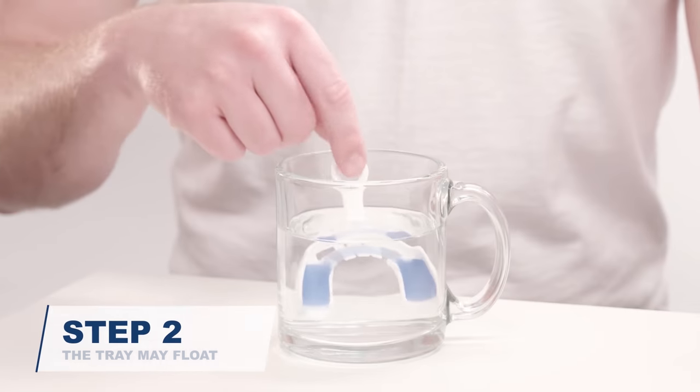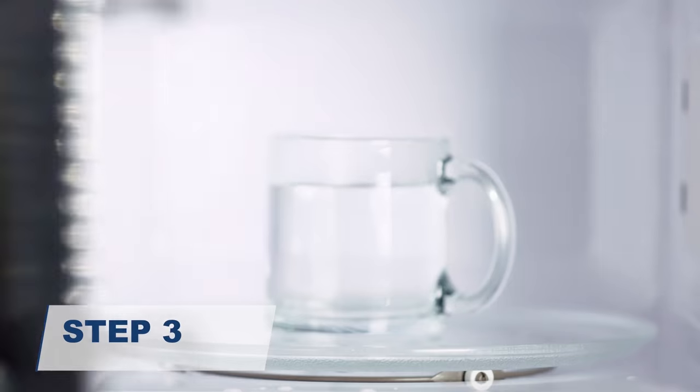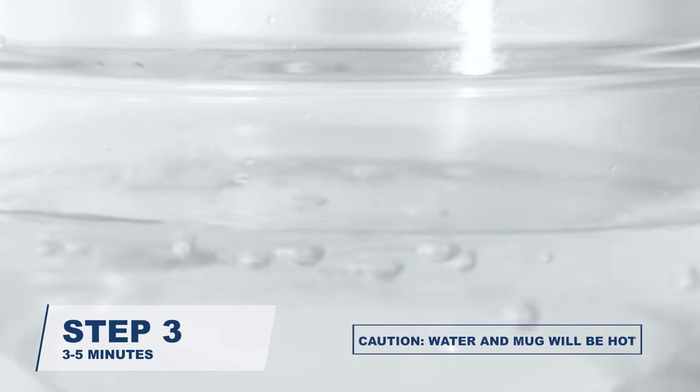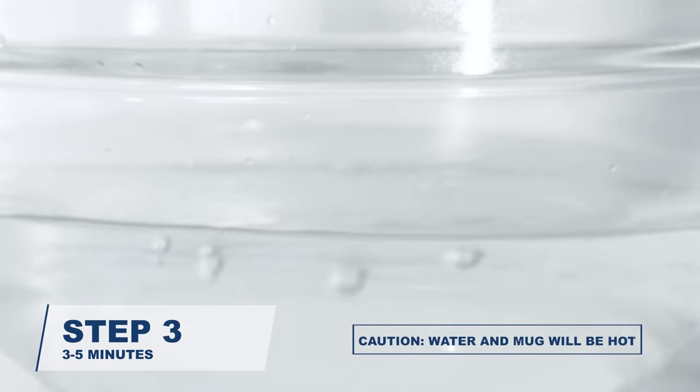Remove the forming tray from the cup. Place the cup inside the microwave and bring the water to a rolling boil. You should see bubbles rise from the bottom of the cup and burst open at the surface. This will take 3 to 5 minutes.